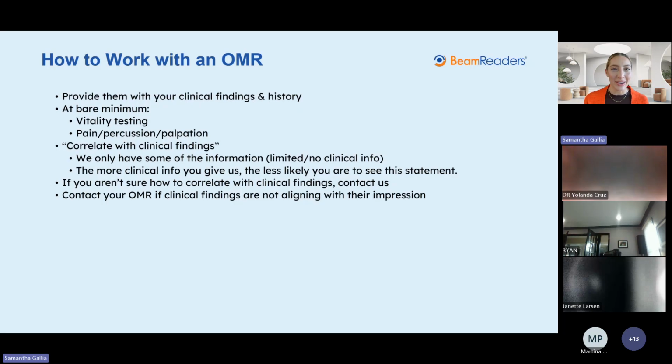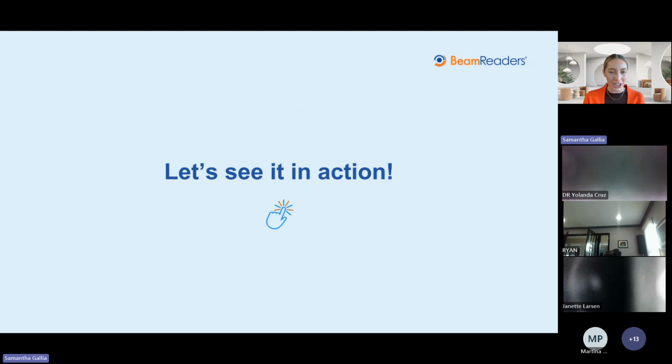And if you're ever a little confused on what those things mean, go ahead and just message us and say, hey, did you mean this by this? Or can you give me a little bit more clarity than that? And we're always happy to do just that because we're here to serve you guys. So let's see it in action.